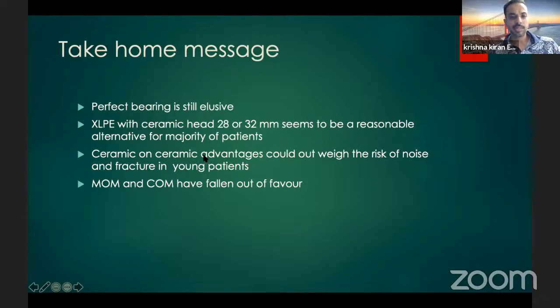The ceramic on ceramic advantages could outweigh the risk of noise and fracture in very young patients, but care must be taken for ideal component positioning, and intraoperative assembly of the components must be meticulous in order to get a successful outcome with ceramic on ceramic. Metal on metal and ceramic on metal have definitely fallen out of favor. Thank you.